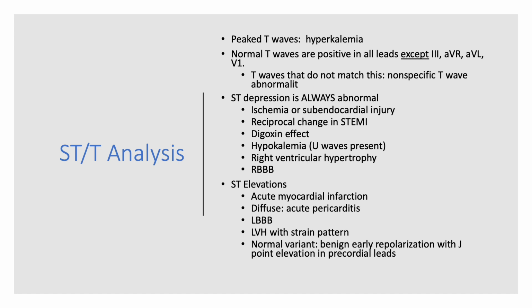So there are examples of these on lifeinthefastlane.com. I would highly recommend that you take a look at that website to see how many differences in morphology there are in the ST segment and T waves. It's a great resource, and going through all of those is beyond the scope of this particular workshop. So I would encourage you, after you get done going through this workshop, to move on to that website and take a look.